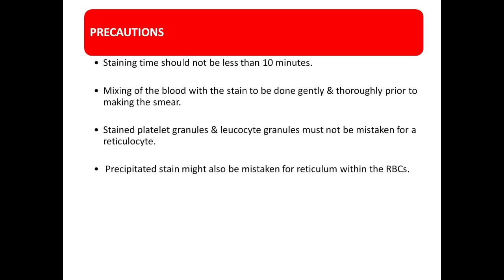Now what are the precautions to be taken? So staining time should not be less than 10 minutes. Mixing of blood with the stain to be done gently and thoroughly prior to making a smear. Stained platelet granules and leukocyte granules must not be mistaken for a reticulocyte. And precipitated stain might also be mistaken for the reticulum within the RBC. So that also you have to see carefully.